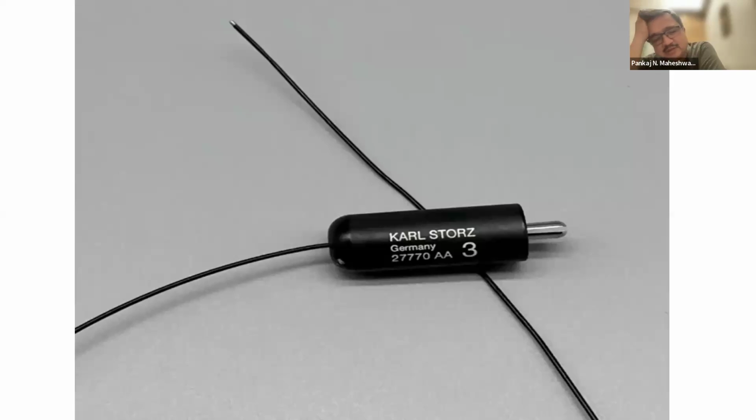Are you aware about the rack and pinion resectoscope? What is that? मैंने देखा नहीं सर. Earlier time it used to be used. We had a very senior urologist in Mumbai who used to regularly use it. Like here we have the finger operated equipment which you use to move your loop.